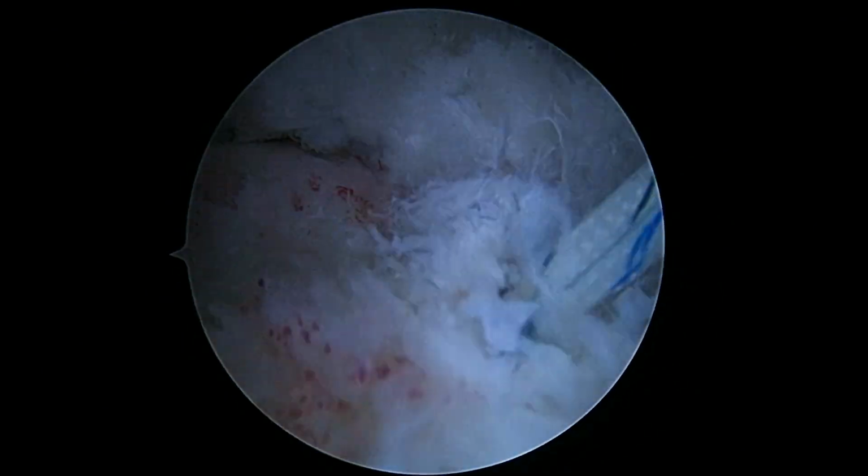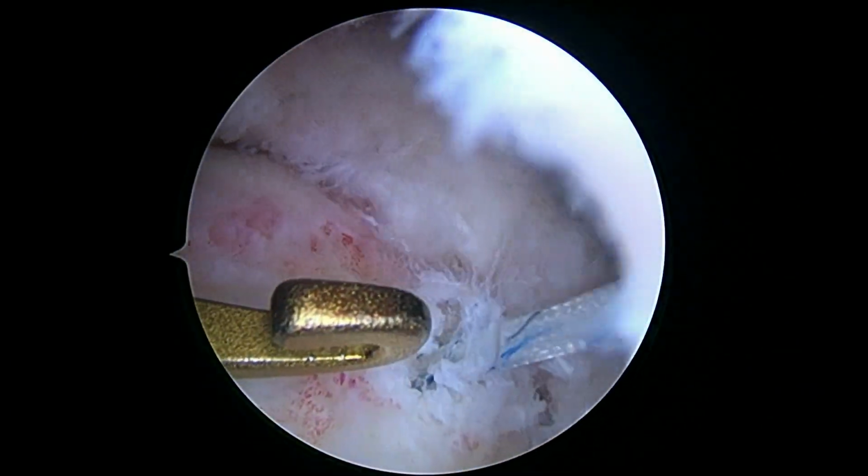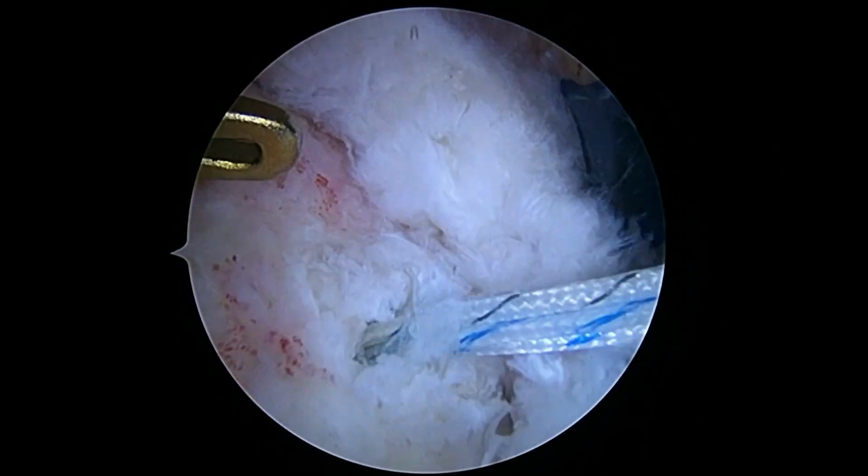Okay, so there's the first triple loaded anchor. We start way in the back. And then we'll reach in here from the front as soon as I find myself. There I am. And we'll grab these sutures and pass them one at a time from the back to the front.